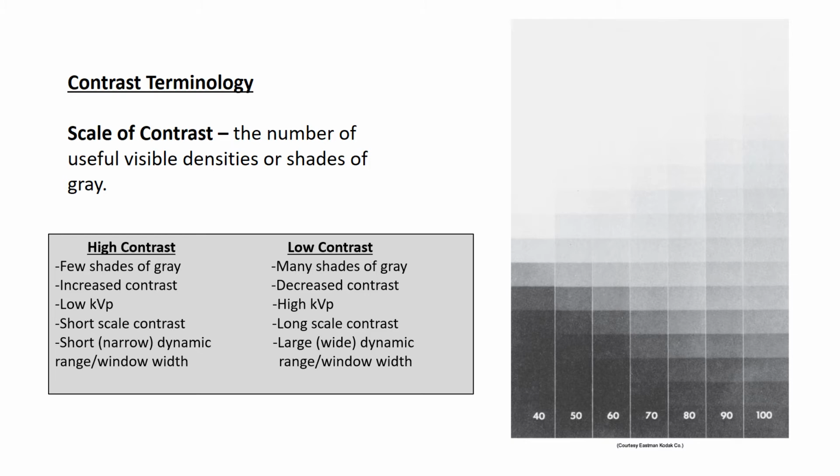You can also call this a short scale contrast. So high contrast, low kVp, short scale of contrast.